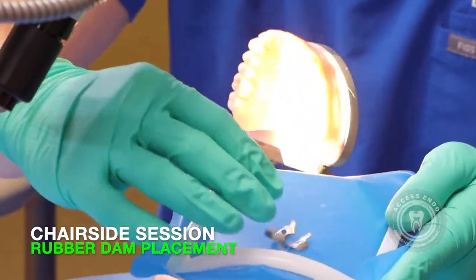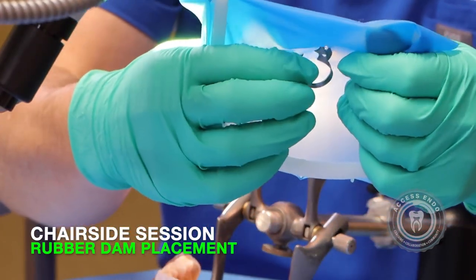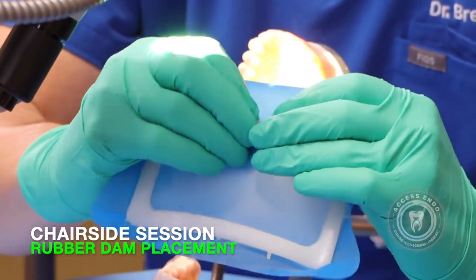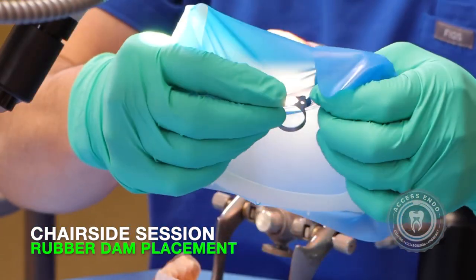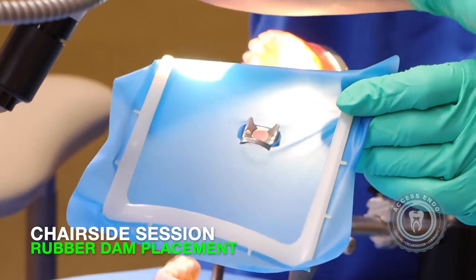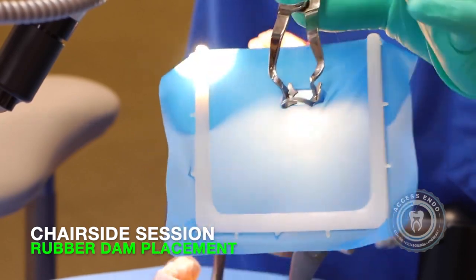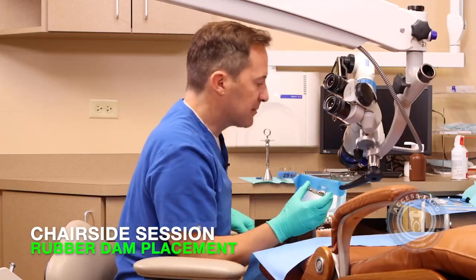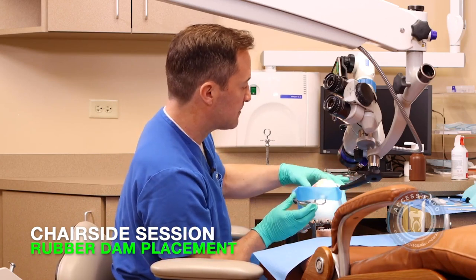So this is an upper molar. What we're going to do is fit it — we place the rubber dam clamp in position, and we just tease the rubber dam around the little wings. And there it is, it's all in position. Make sure it's nice and neat, and now it's ready to go. So then we'll take our rubber dam forcep and put it right down into the little holes here. This allows us to have a very nimble way to place this rubber dam — it gives me an opportunity to move it and maneuver around the soft tissue.